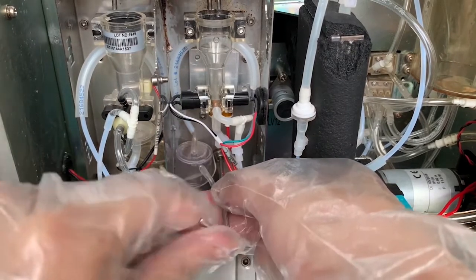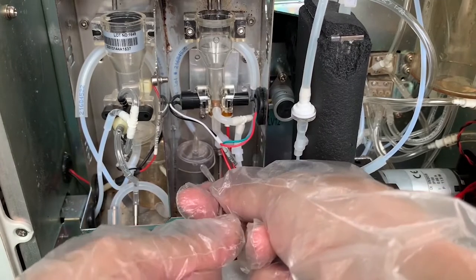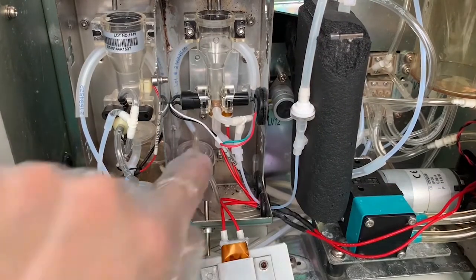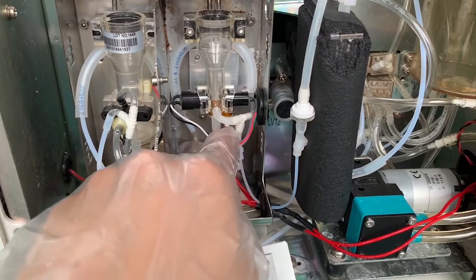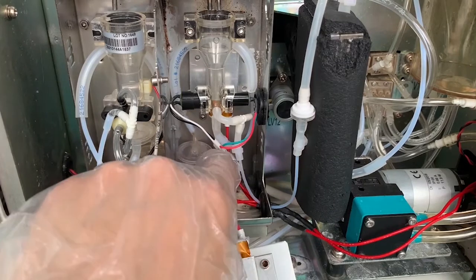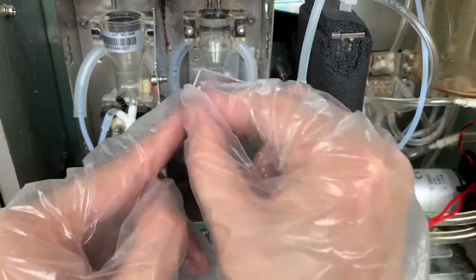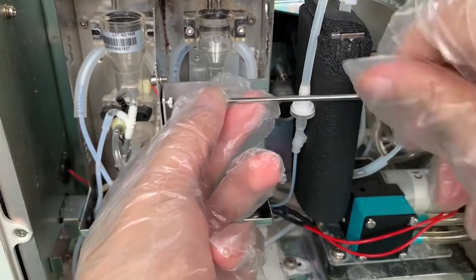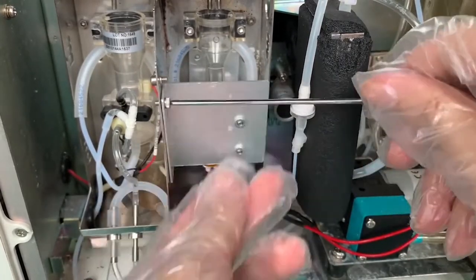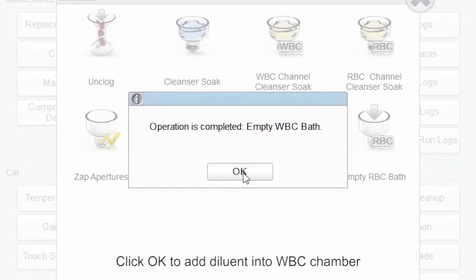Tighten the screw. Make sure all the tubes cannot be folded or pressed. Install the heating plate back. Click OK to add diluent into the WBC chamber.